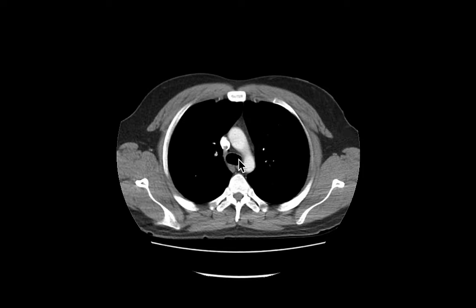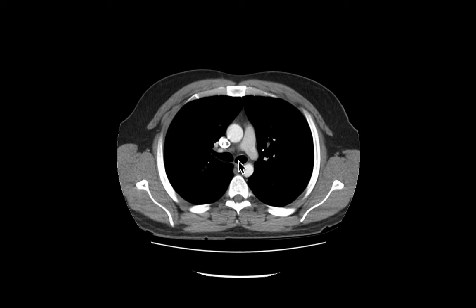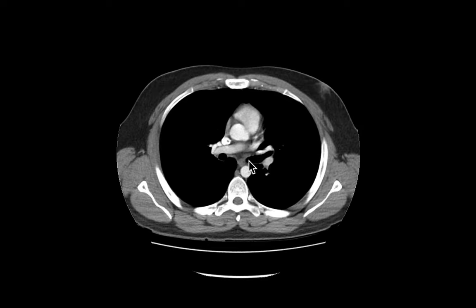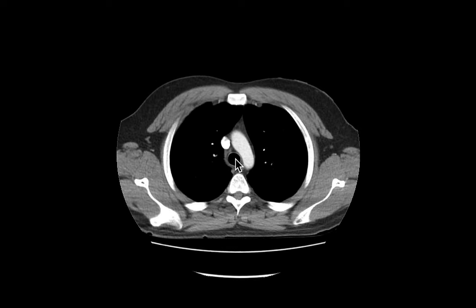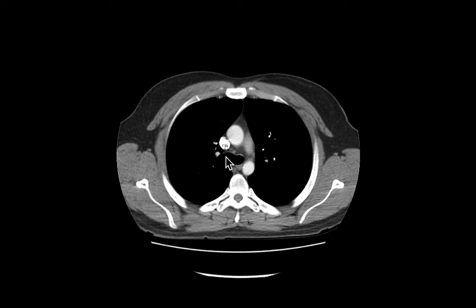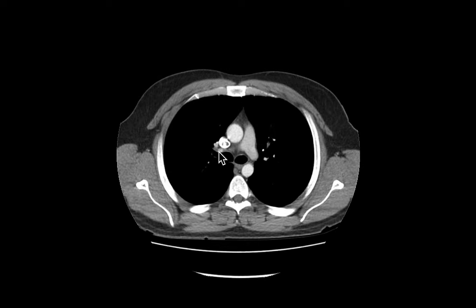Let's follow the left one out: trachea, left mainstem bronchus, and then it branches — in the left lung there are only two lobes, so it becomes upper and lower lobes. We see secondary bronchi forming there. And on the right side: trachea, right primary bronchus, and then you get the idea of secondary branching. The lungs form an apex up here right by rib one and the clavicle.